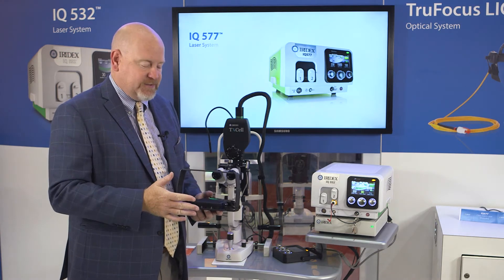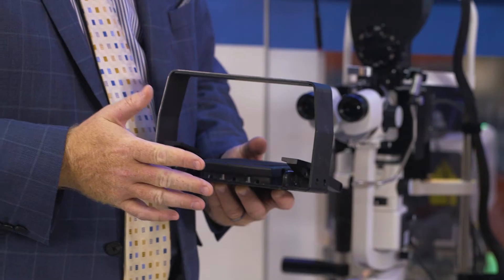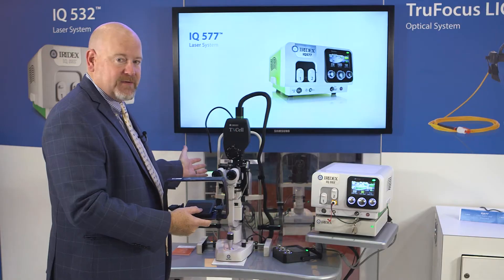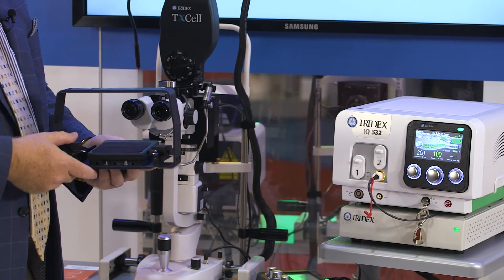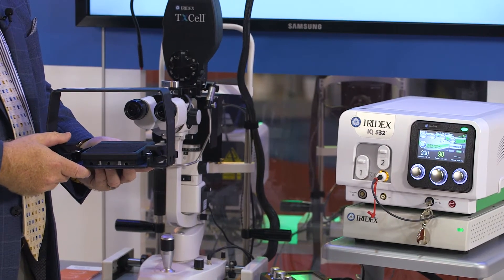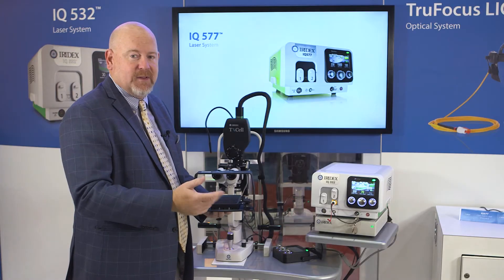The other neat thing about this one, which is the power adjust, is that he can step on the pedal to fire the spots, but at the same time he also can move his foot left or right to either raise or lower the power 10 milliwatts at a time.